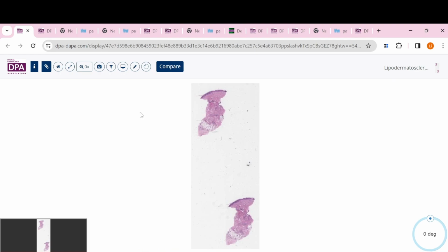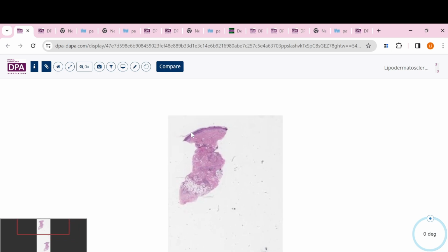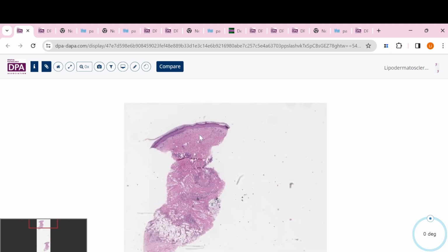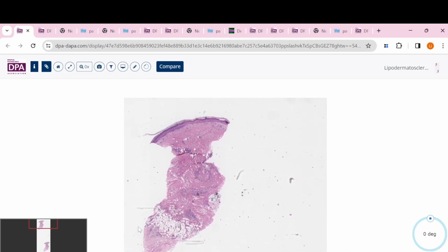And then I put another differential here. This one is called lipodermatosclerosis. The reason why I put this one is this lesion actually falls into the panniculitis chapter. For this lesion, we usually see stasis dermatitis changes in the superficial dermis, the papillary dermis. But when you see a big punch that goes deep into the subcutis, usually you won't think about stasis dermatitis. You should think of why maybe the family doctor or the dermatologist did this deep punch and included the subcutaneous fat.